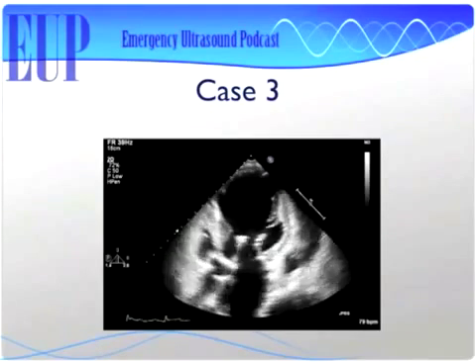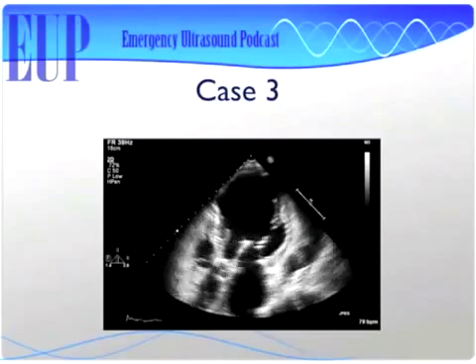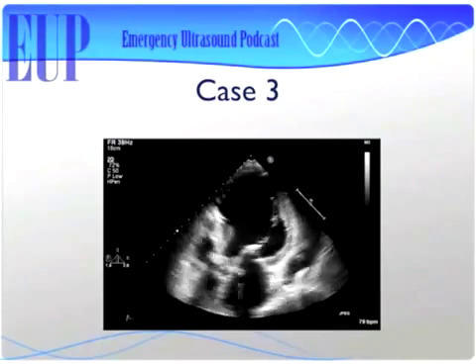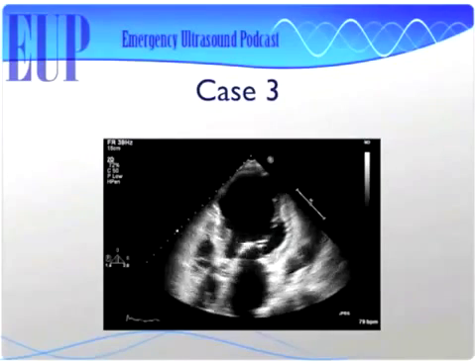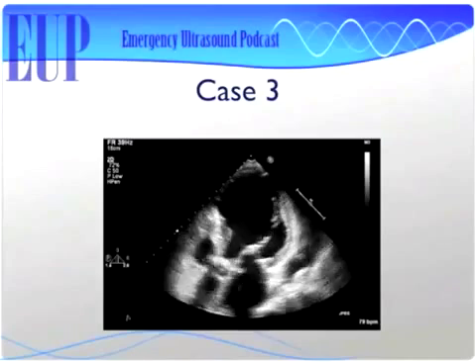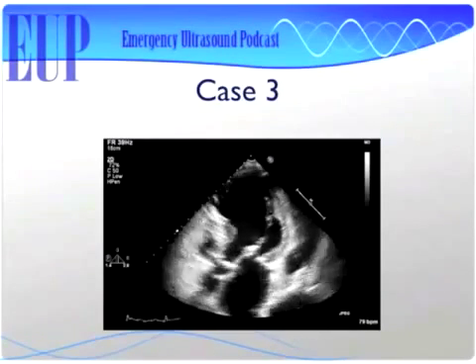All right, case 3. So to round it out, this is our last case, Matt. So you're going to be off the hot seat soon. So what are we looking at now? Is that like an apical 3.5 chamber view? This is an apical 3 3/4 chamber view. Yeah, what is this? I love it when you make fun of the echo.